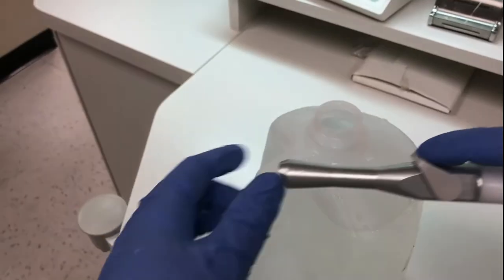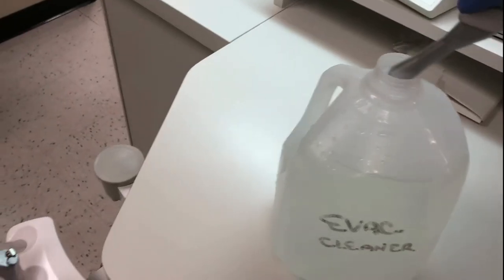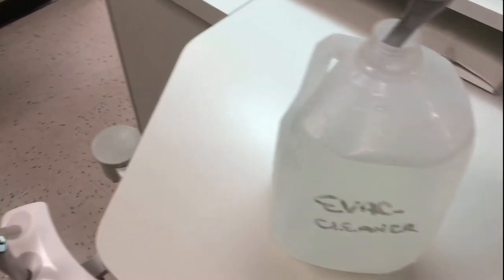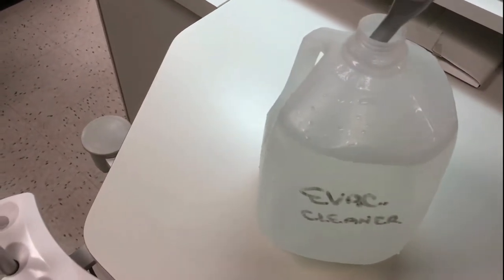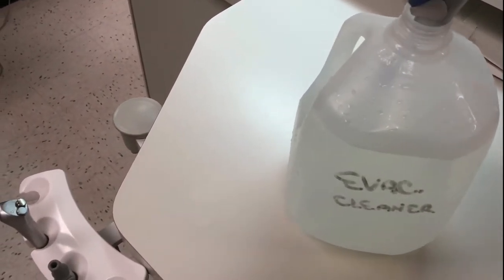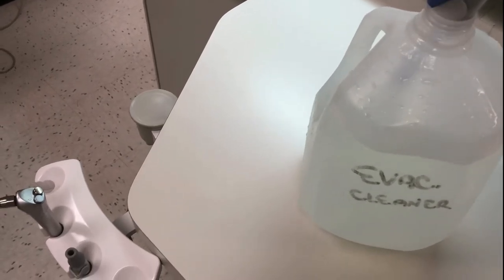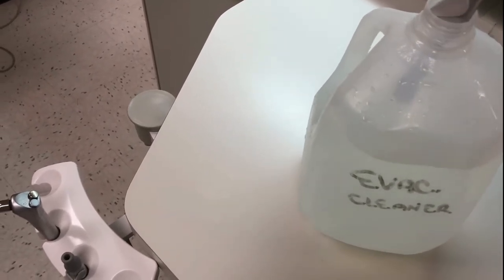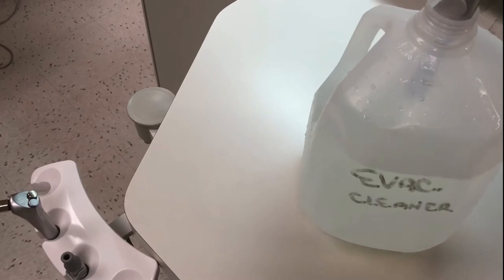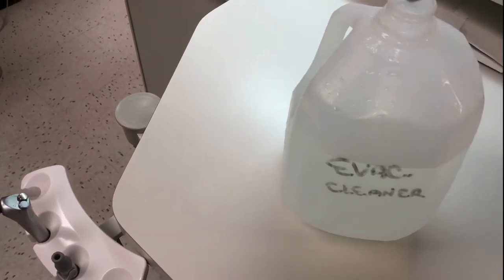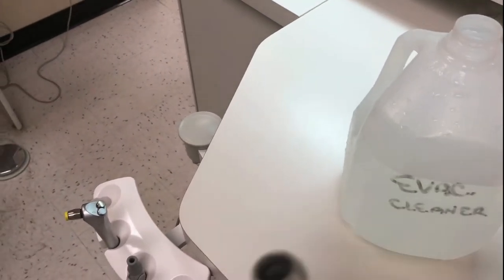Do the same thing for the HVE, making sure the tip of the HVE is placed in and out of the evacuation line cleaner. Use about a half a gallon of cleaner in each operatory.